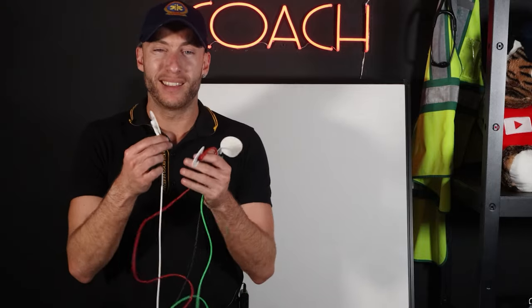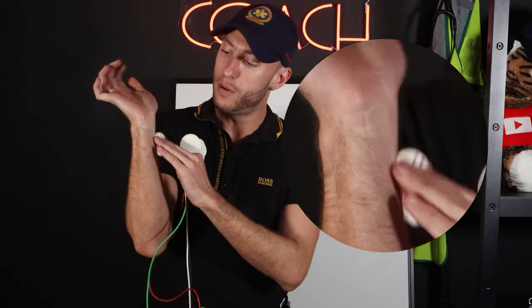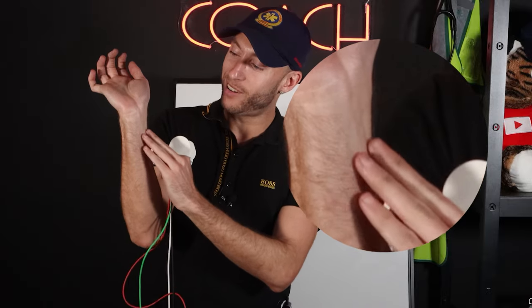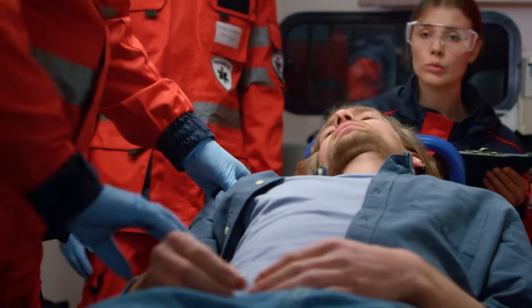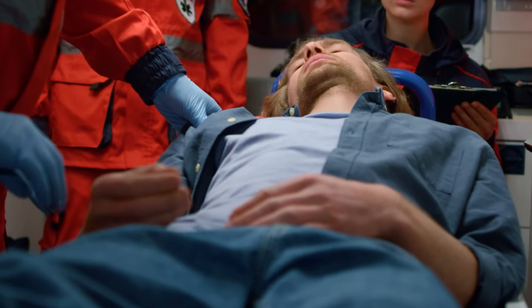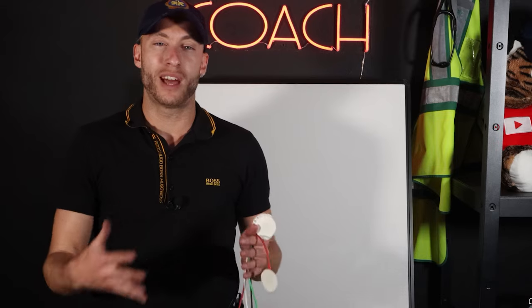Where exactly do you place the electrodes? The inside of the wrist is ideal because there's little hair there, but in EMS with a bumping ambulance and patients moving their hands, it's hard to get a good tracing. A better placement for the arm leads is on the humeral heads — patients won't be moving their shoulders constantly. For the leg leads, go as close to the ankle as possible — on the calf near the ankle area, not up on the thigh.